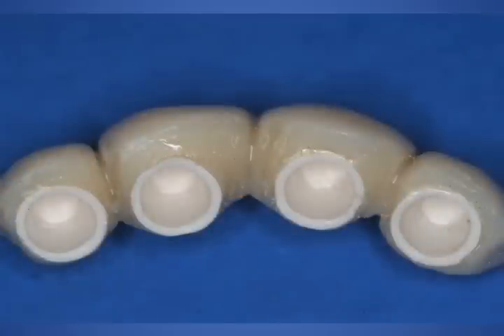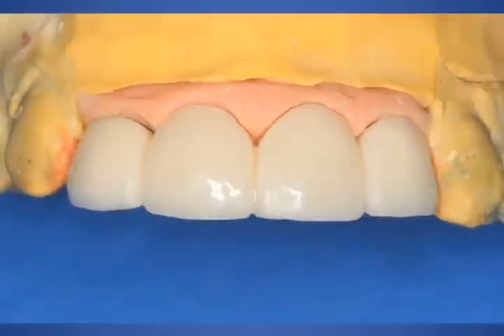Here the dental laboratory fabricated 4 transitional crowns that were splinted together that would be placed immediately after implant placement, surgical placement, using the surgical guide that we'll illustrate more clearly in a little bit. So the dental laboratory has a very important role in determining final aesthetics. Now, we wanted to use the patient's own natural incisal lines and basic contours in determining length and position as possible with the amount of bone that we had.